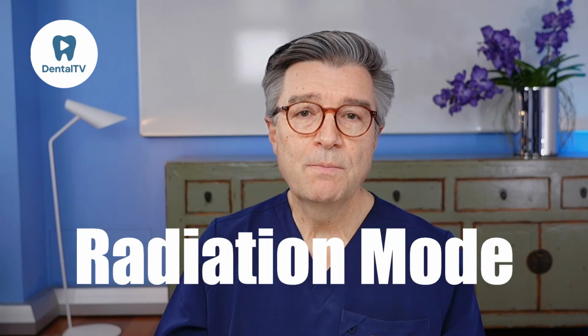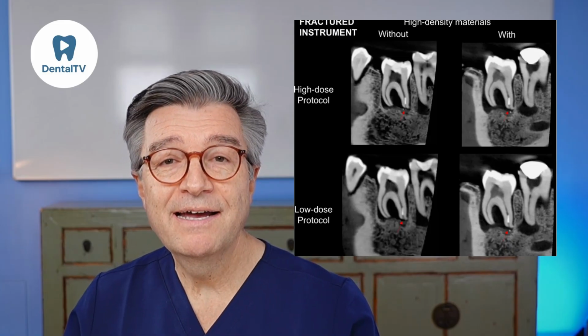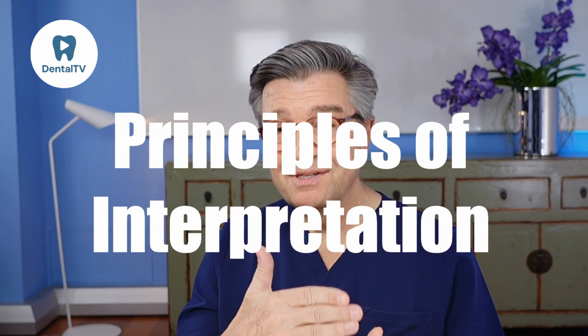Radiation mode also matters. Low-dose scans are excellent for general assessments, but introduce noise and reduce clarity. High-dose scans provide sharper detail, but carry a higher radiation exposure. A clinician must always interpret findings according to the dose mode used and be aware that noise can mimic pathology. With these parameters in mind, we can now focus on the principles of interpretation.